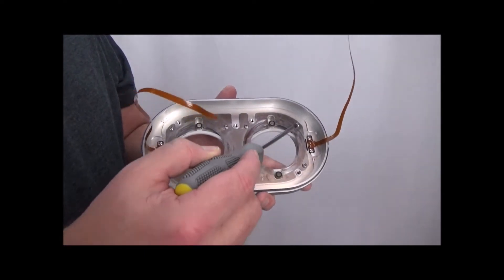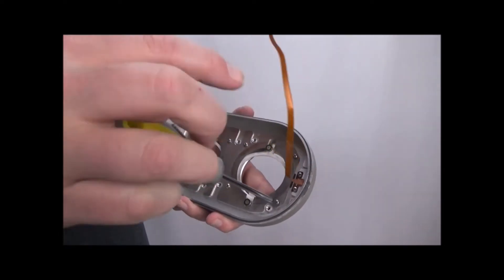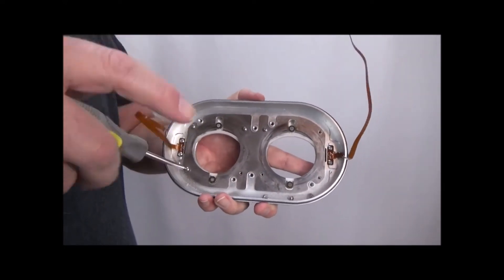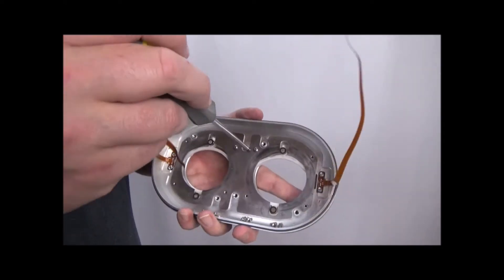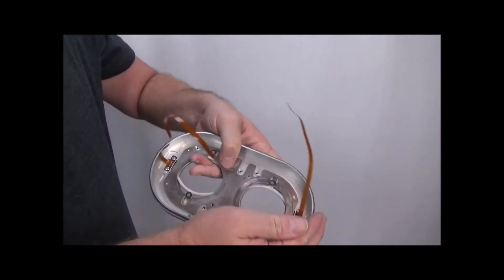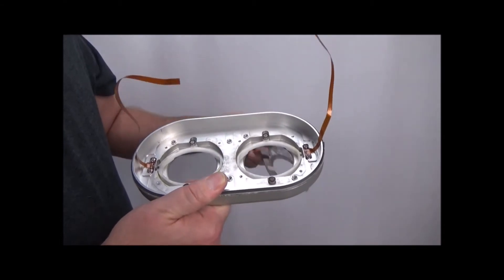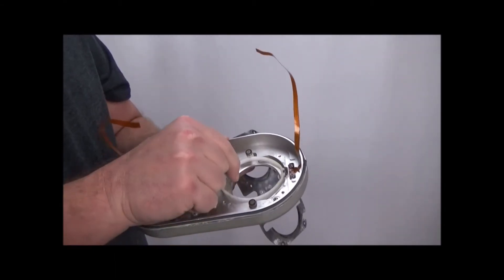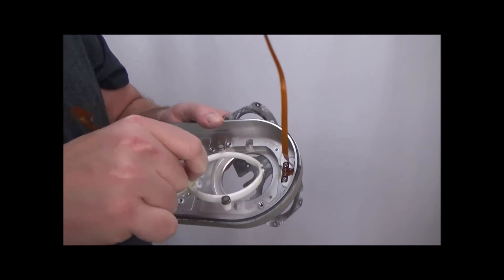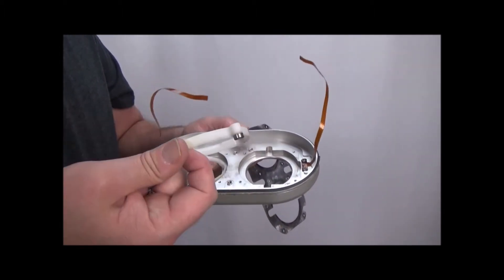The next thing we need to do is remove these eight screws holding this plate on, then remove the plate. And here are your Hall Effect Sensors. There's the magnet that goes up against the Hall Effect Sensor. So if you need to replace this or clean it off, this is how you get to it.